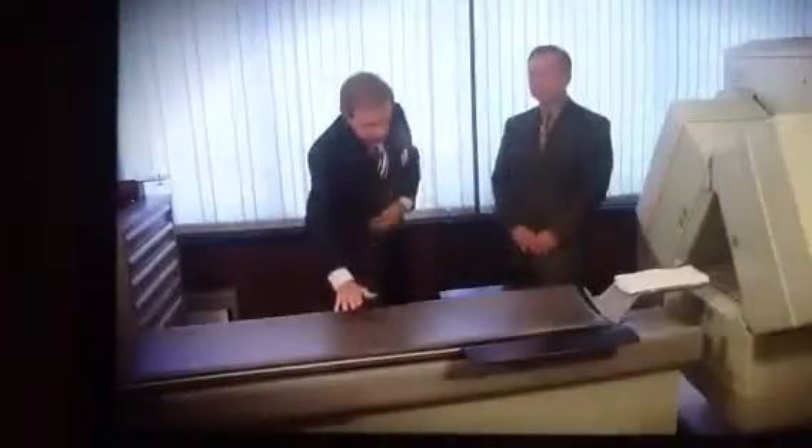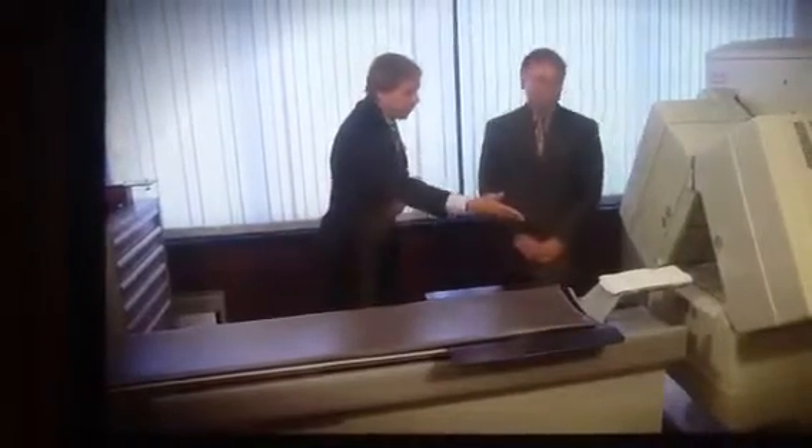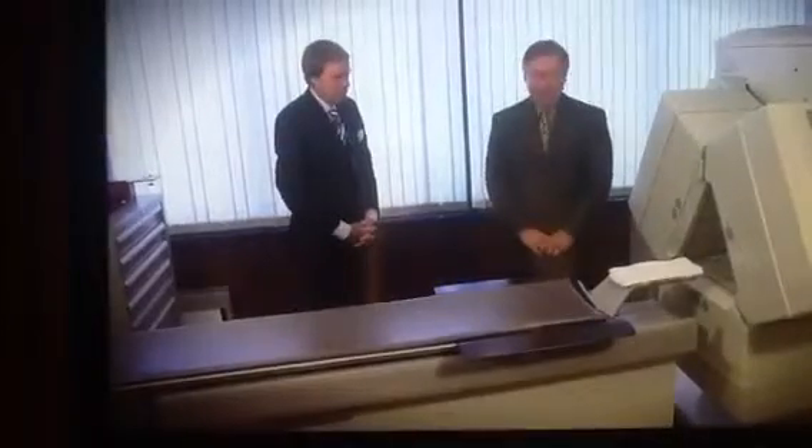Welcome back. We have traveled over to the scanning room. As you'll notice in front of me, this is where the patient would lie down. Here's her back. The head goes here. Tell us what happens after that.